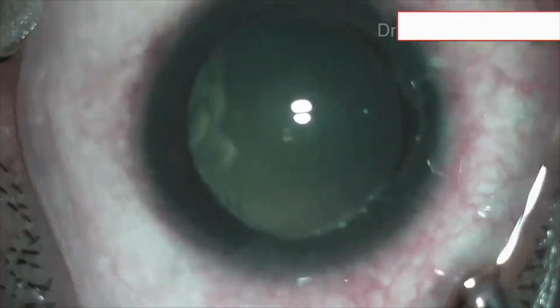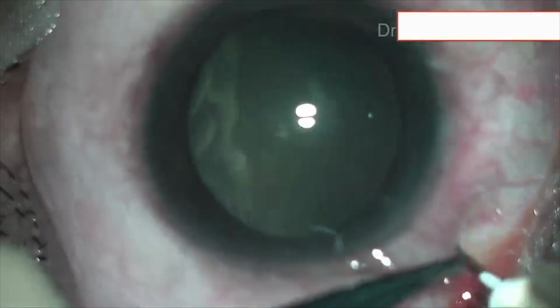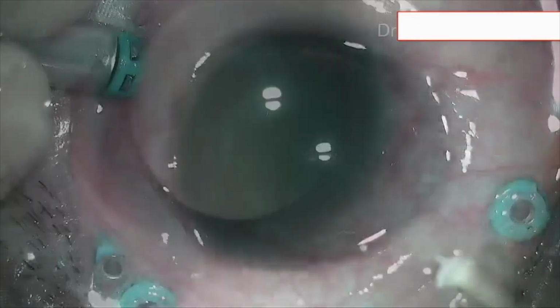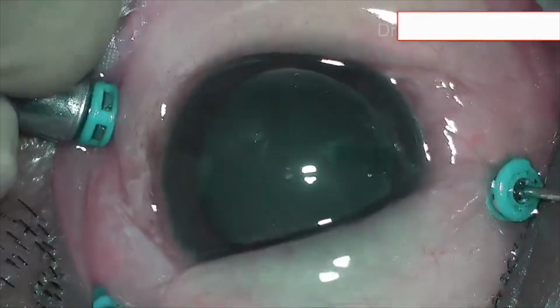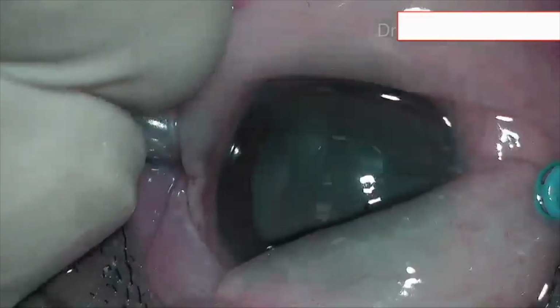I almost landed in this dreadful situation, operating on a total rhegmatogenous retinal detachment with considerable hypotony. At the start of the case, I injected balanced salt solution intravitreally to build up the IOP, then introduced all the cannulas. Vitrectomy was completed without trouble. The posterior pole retina was settled with heavy fluid PFCL. Air-fluid exchange was started to flatten the peripheral retina.